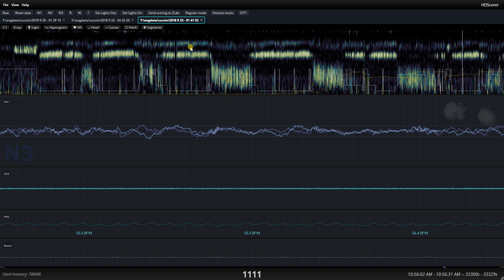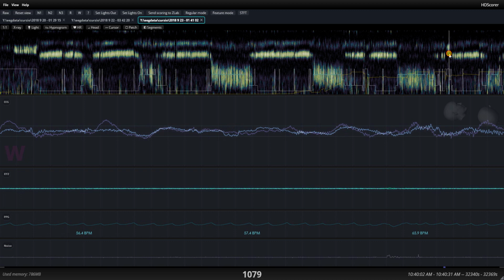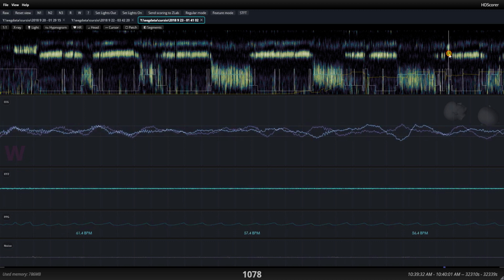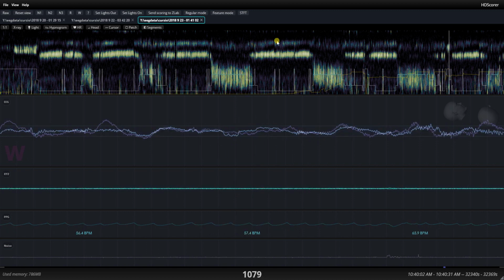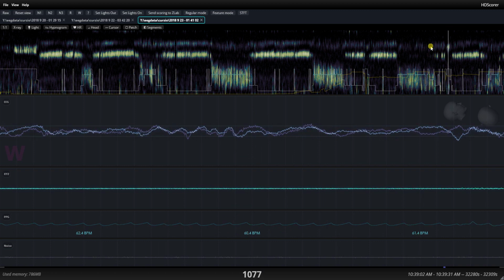Then again, during sleep cycles, the amount of theta is completely random. Like here it's mixed, coming and going. Here it's very strong. Here it's almost nothing. And so to realize that this is the right intensity and the right spot to consider it alpha, and to be able to do that on many subjects with different phenotypes, that's quite big. And I have to say my phenotype is not one of the easiest. It's easy for some things. For example, my alpha doesn't much overlap the spindle frequency, but for other things like I've articulated, it's hard because alpha and theta are different.